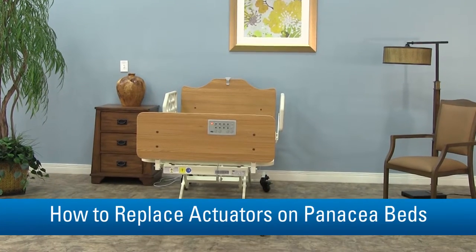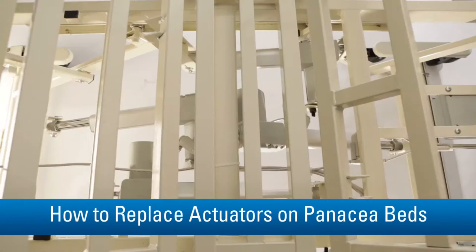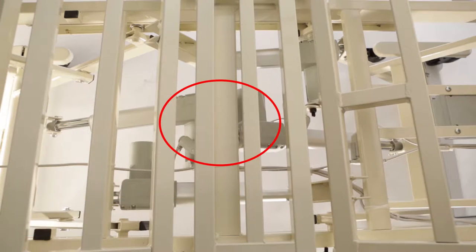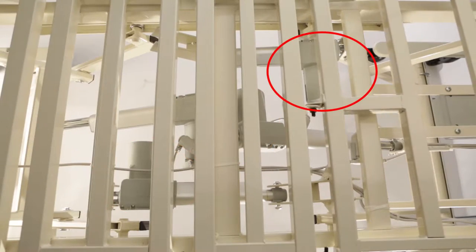Begin by making sure the bed is empty and unplugged and that you have plenty of space to work. You'll then want to identify which actuator you need to replace: one of the two high-low actuators, the head-deck actuator, or the knee-deck actuator.